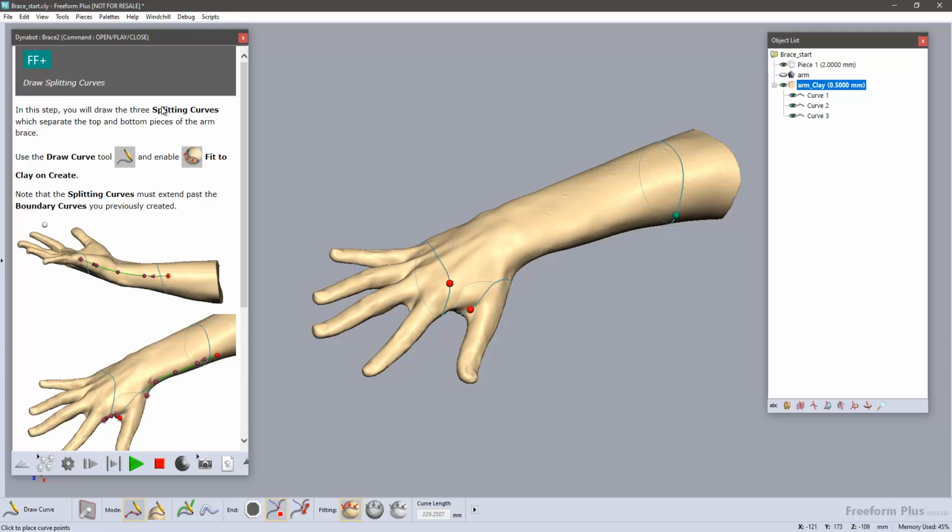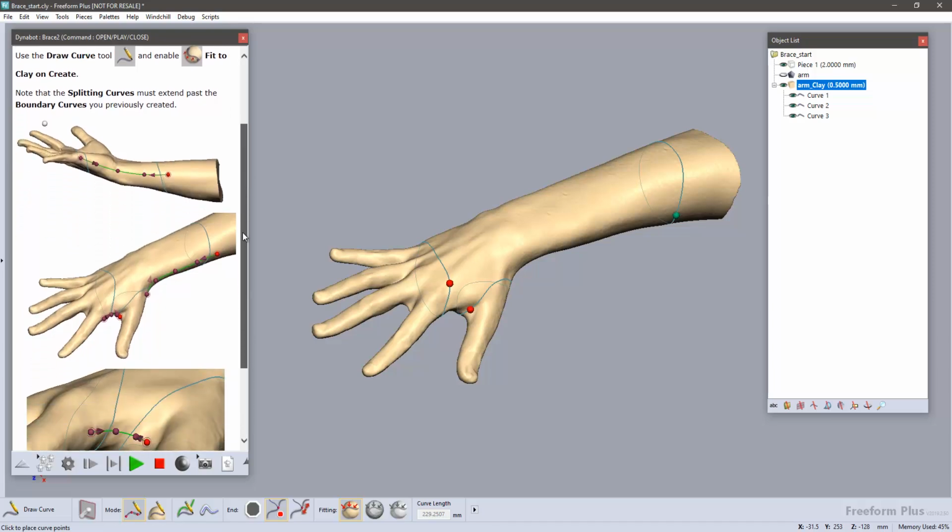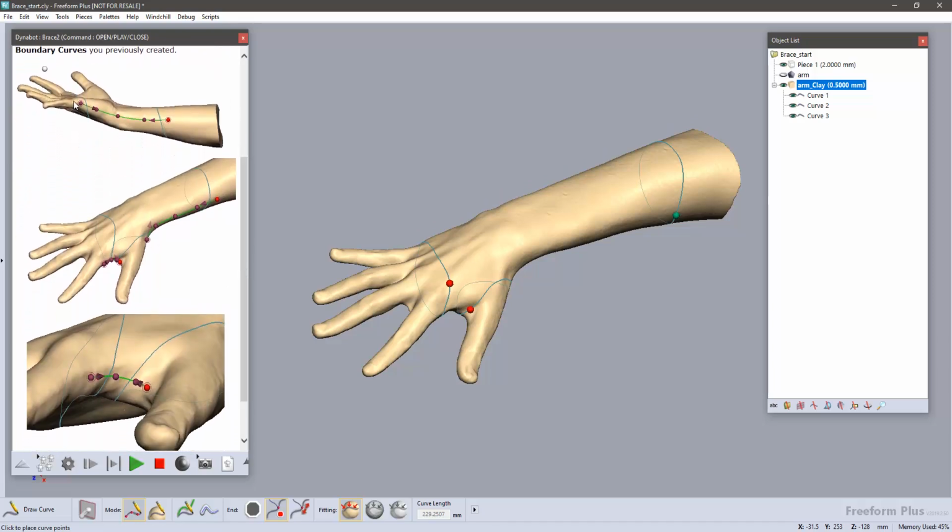The next step has splitting curves. So, because I'm already in the Draw Curve tool, I don't need to click this or click to fit. I'm already in that tool in mode. And what I'm going to do now is draw 3 separate curves, one on the outside of the wrist, one on the inside of the wrist, and one between the thumb and index finger.